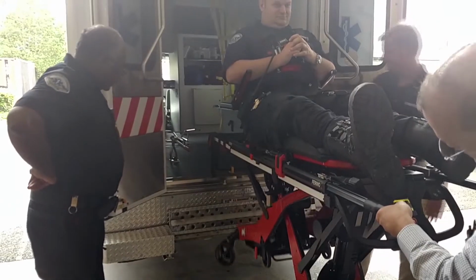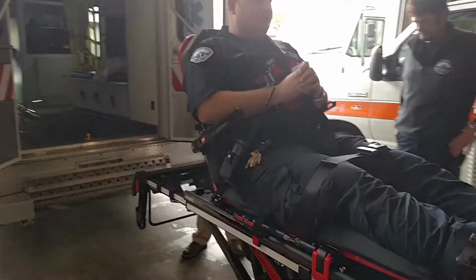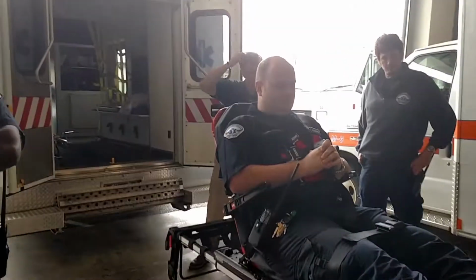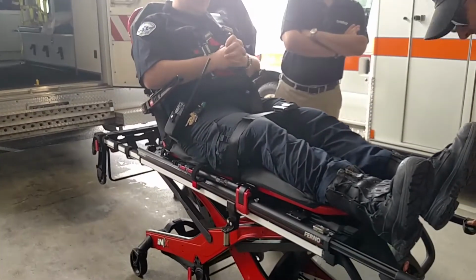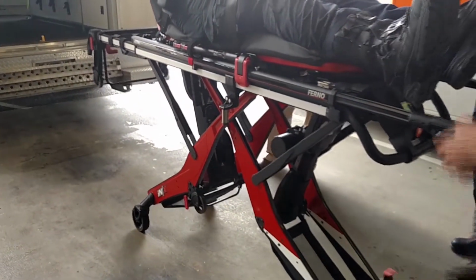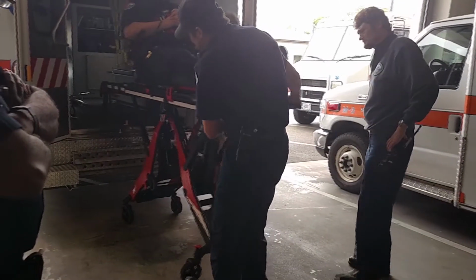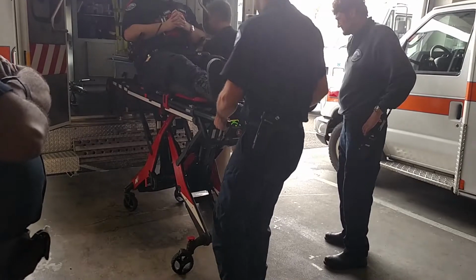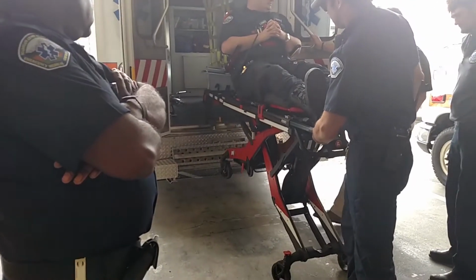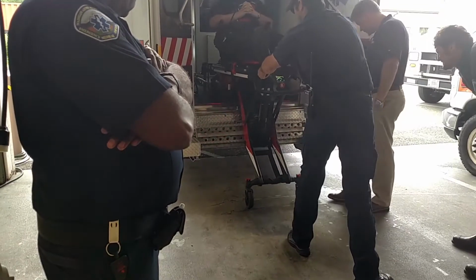Plus. And come on out. Roll it over some gravel or block dust or something. All right, driver's test next. Give me med 2. Okay, you're passing all our skills here. You have to do that every time. Okay, stop. Wear out the battery. And let it back, minus. Nope, nope, a little more. There you go. Now you're through.